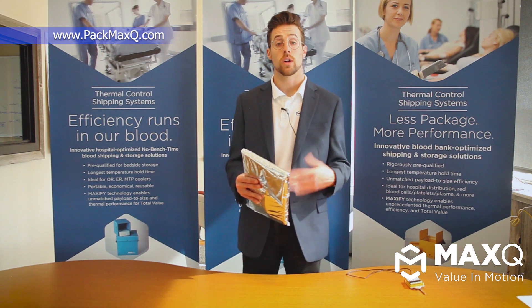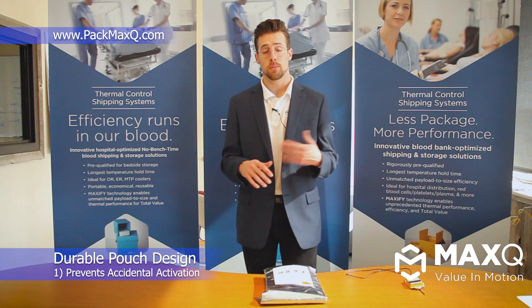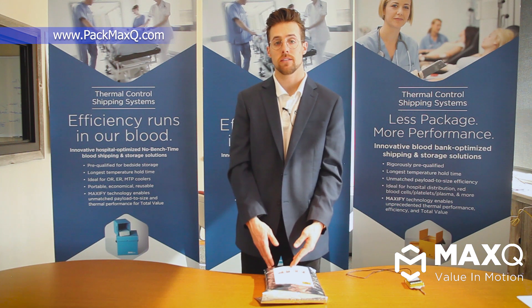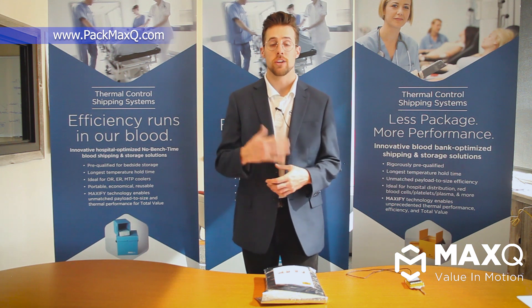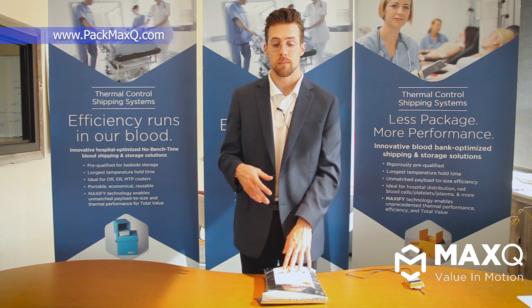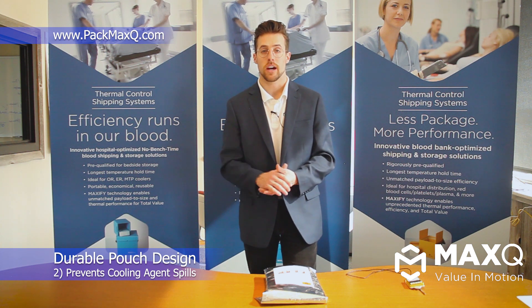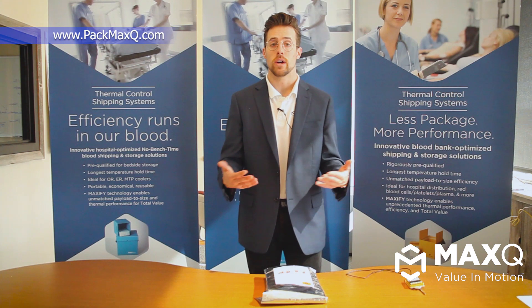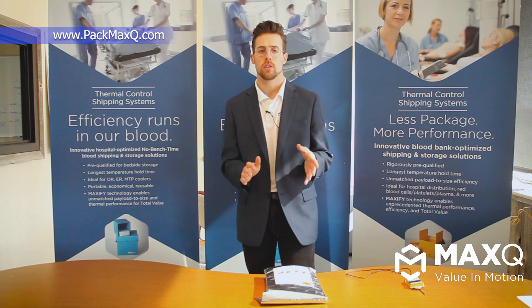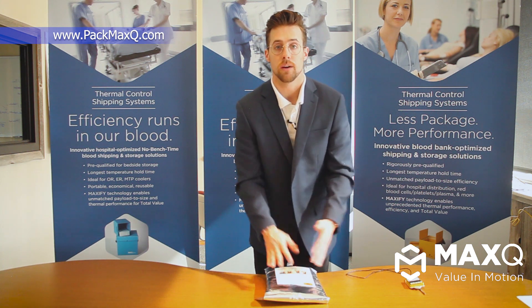Another tip is about the reacting agents themselves — they are packaged in a very robust pouch for a couple of reasons. Number one is to keep the pouches from accidental activation upon shipping to customers. We don't want you to receive the pouch with the active ingredients already popped. The second reason they're durable is to make sure the pouches wouldn't burst and the reacting chemicals spill everywhere. They are designed to be somewhat difficult to pop intentionally — we don't want accidental activation and we do not want any reagent leaking anywhere. It will get easier over time as you get the feel for how to pop those internal agents.